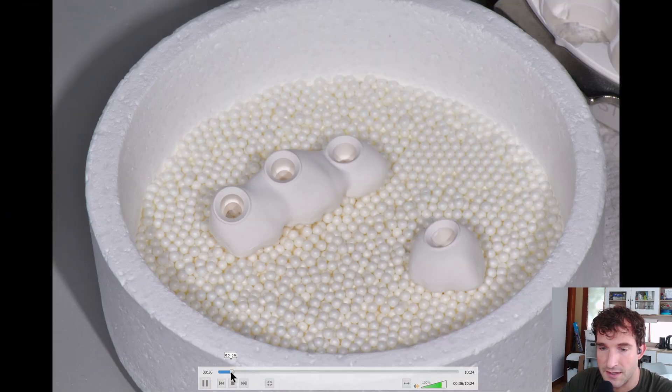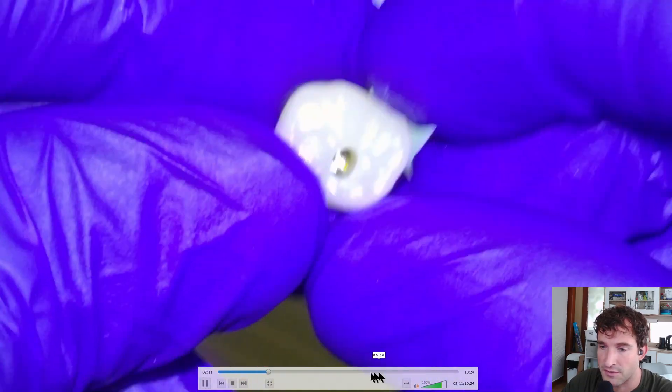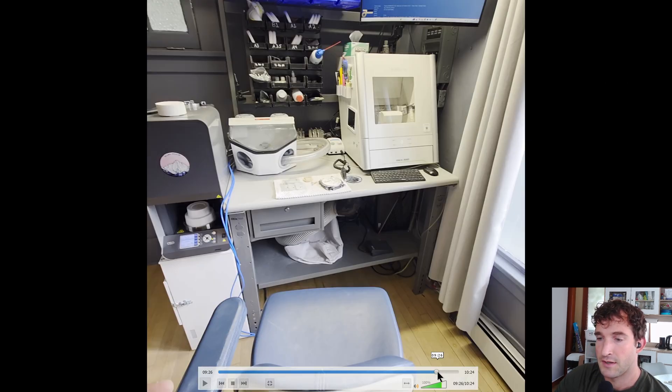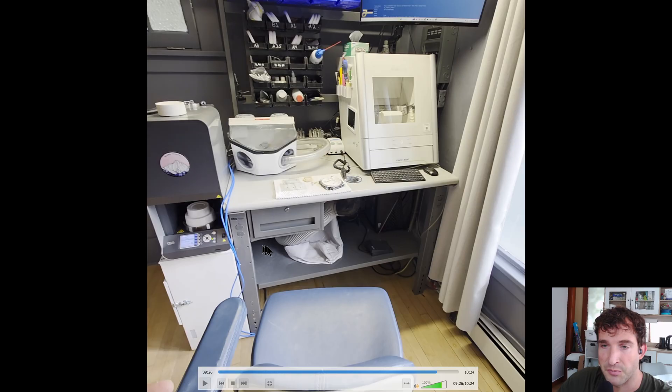So here's the Exocad design, the milling of the unit, sintering, polishing, bonding the abutment, and then installing the unit. And then the last minute of the video will just be a little tour of the lab that I have in the back that I use to make any of my zirconia products.